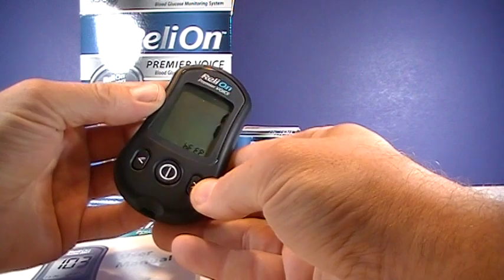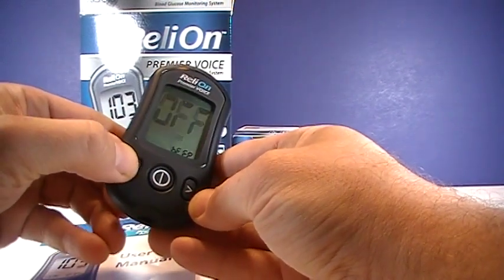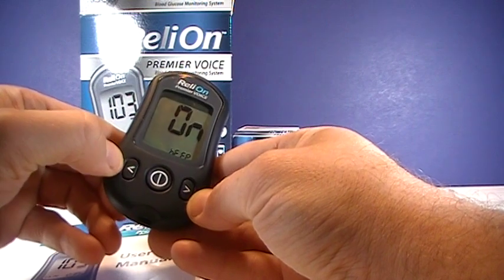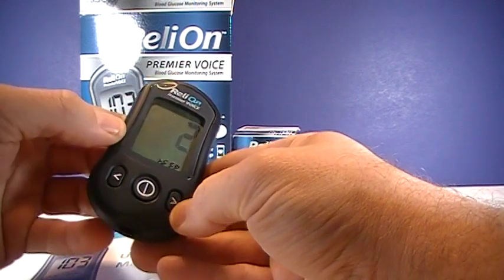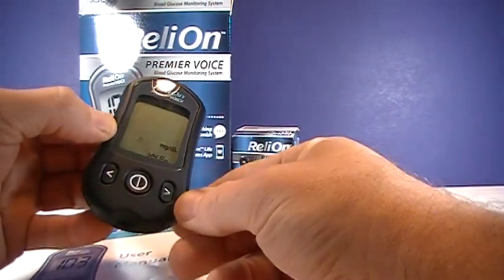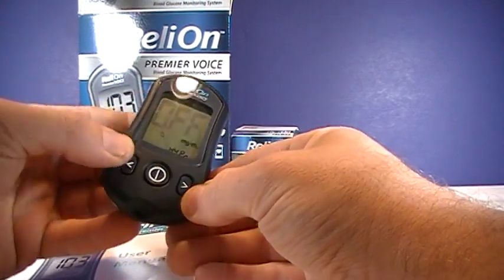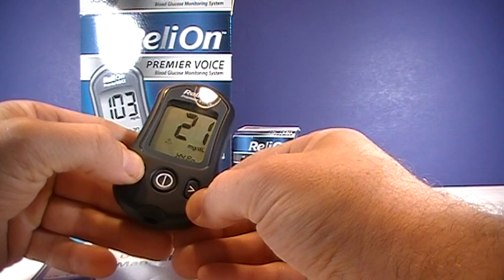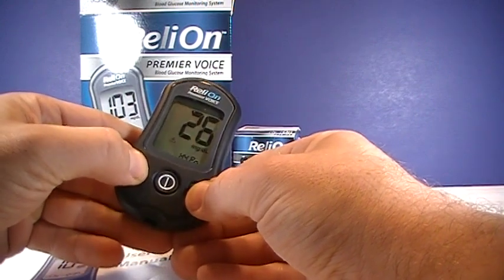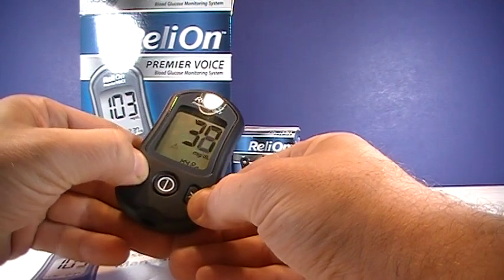Next is set volume, which you adjust to your preference. Then there's the hypoglycemia indicator — this is a low blood sugar indicator you can turn on or off. If you turn it on, it gives you the option to set what reading you want that indicator to trigger at.